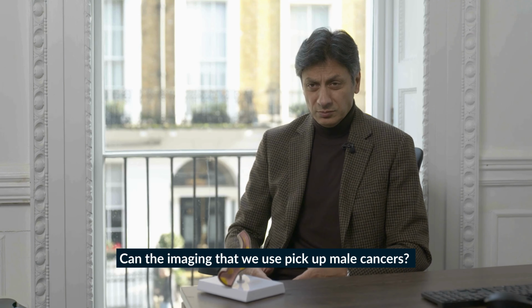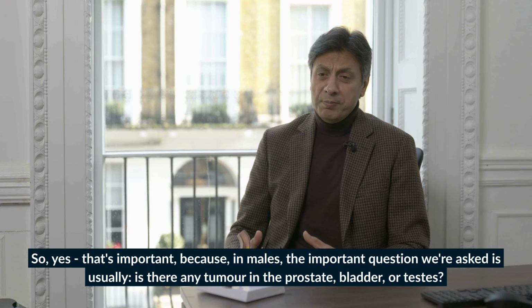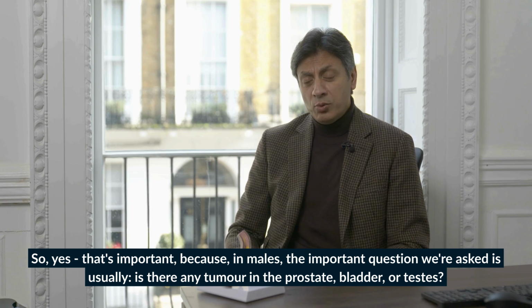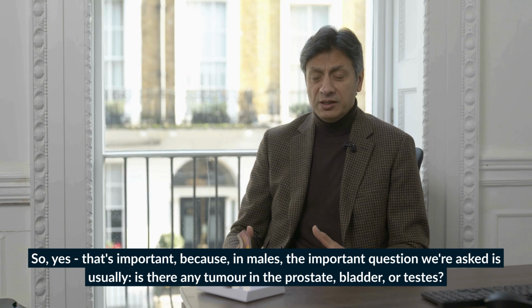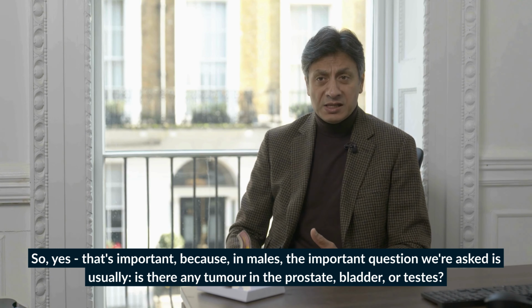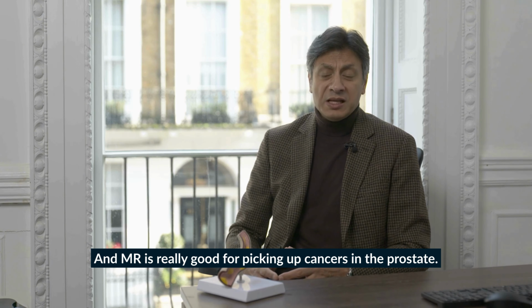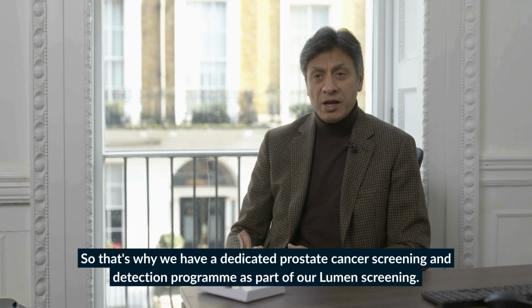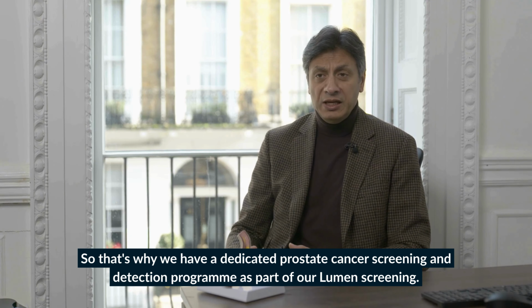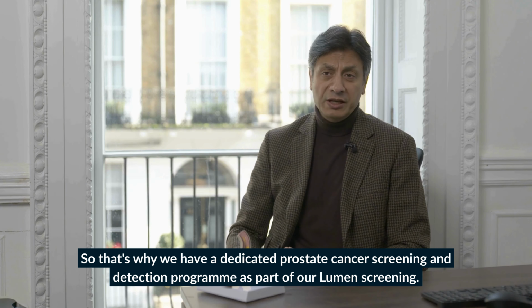What imaging do we use to pick up male cancers? Can the imaging pick up male cancers? So yes, that's important, because in males the important questions that we are usually asked is, is there any tumor in the prostate, bladder or testes? And MR is really good for picking up cancers in the prostate. So that's why we have a dedicated prostate cancer screening and detection program in our Lumen screening settings.